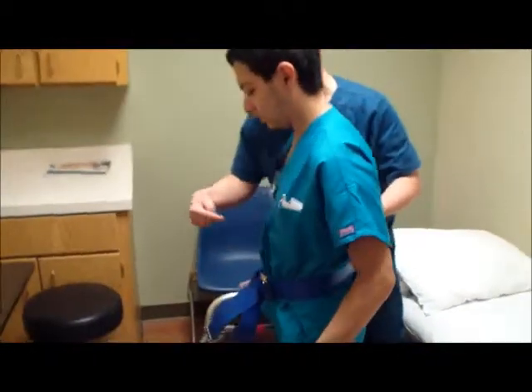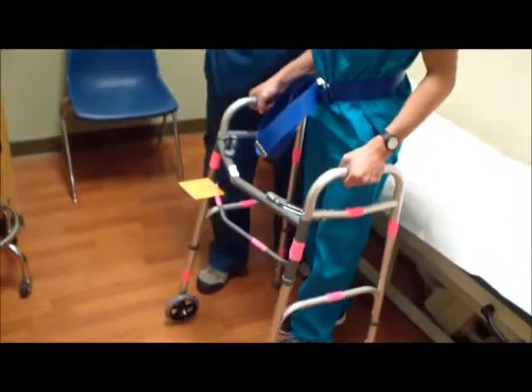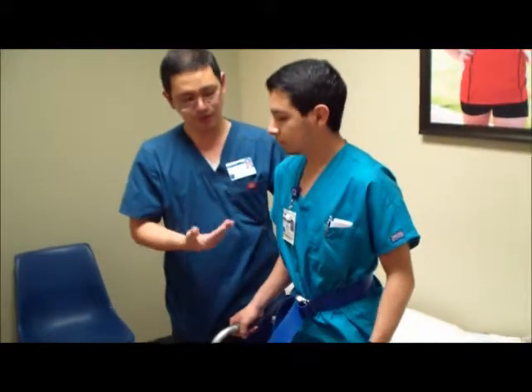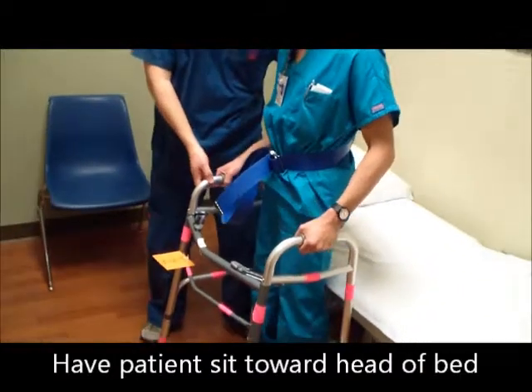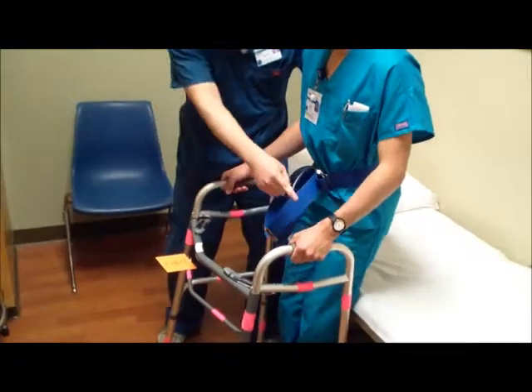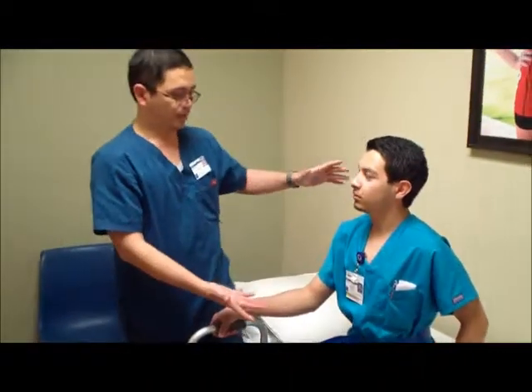And then we're going to back up towards the bed. Since you want the patient to be in a good position when he goes back to bed, I would ask Matthew to step sideways towards the head of the bed, keeping yourself inside the walker, and go ahead and sit down slowly, bending from your hips and your knees, and reach back with one of your hands. There you go. That way, when he lays down, he'll be in a good spot and you don't have to scoot him up too much.